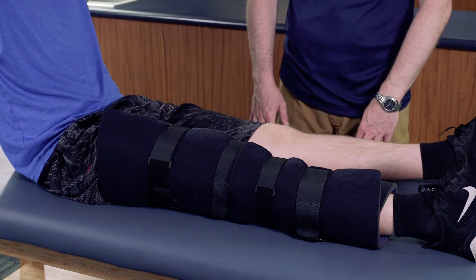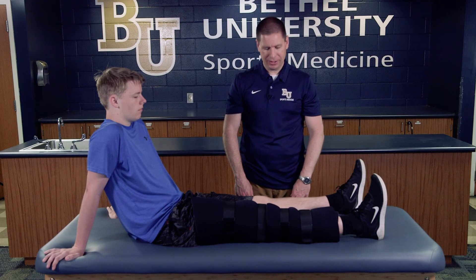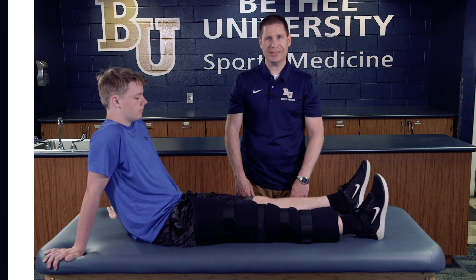Generally we typically only like to keep athletes in this for anywhere between 48 and 72 hours, just to make sure everything calms down and the athlete is taken care of. As long as it's snug, secure, and feels okay, we're all set.